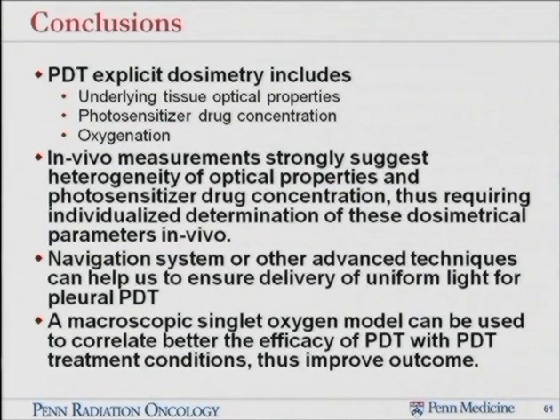So in conclusion, we have this explicit PDT dosimetry that can be used to determine the tissue optical properties, sensitizer drug concentration, and oxygenation, which is hemoglobin concentration, and then our model can be used to correlate to the oxygen concentration in tissue.